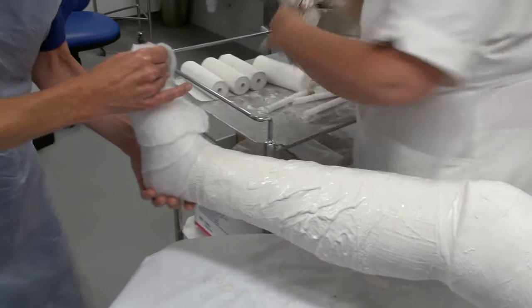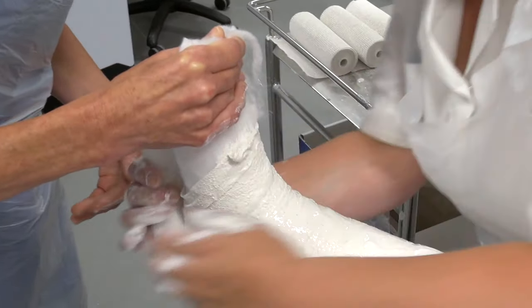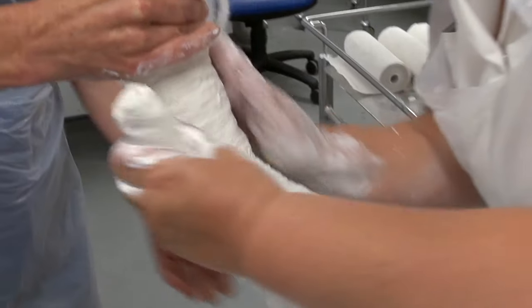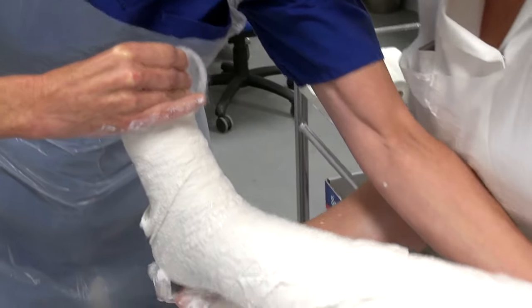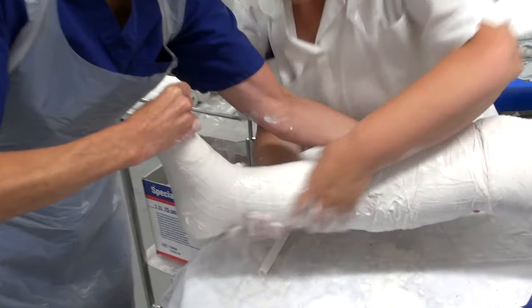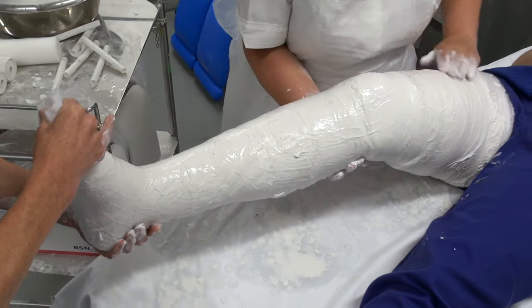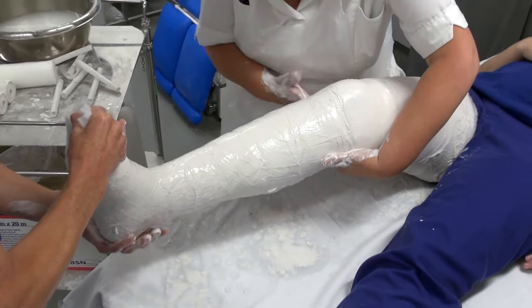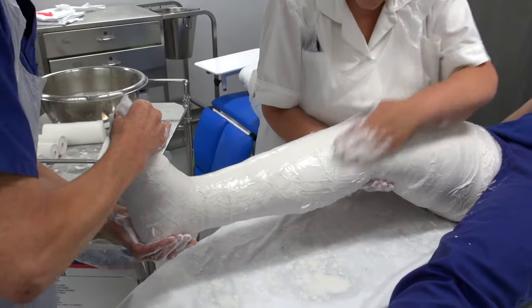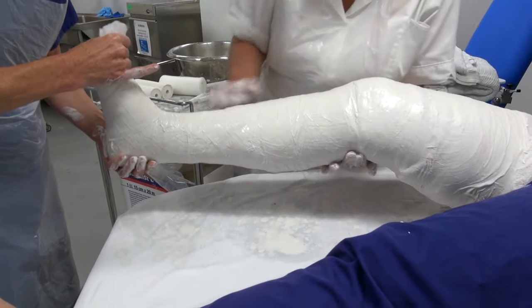Now doing the foot — I'm holding Ann's foot by the end of the toes. It's important to keep the flex in there. While this is hardening off, we keep that knee in the flexed position and the foot needs to be at 90 degrees. I need to check that there's no eversion or inversion of the ankle.